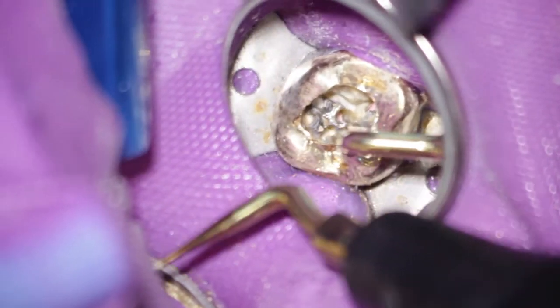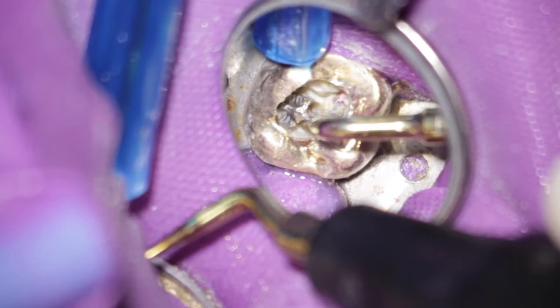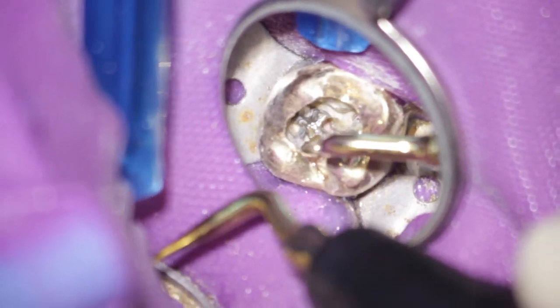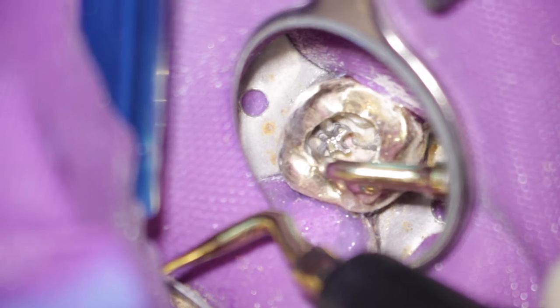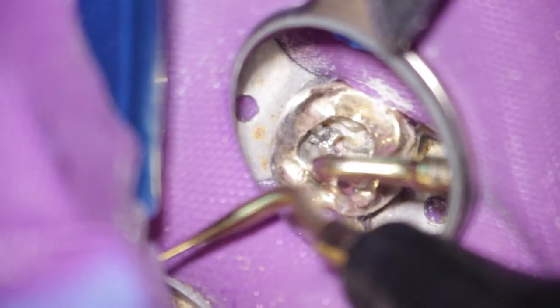And now it's time to use ultrasonic tips to free the gaps from the cement and resin. This is a coated Pro Ultra tip from Dentsply that works best with a piezoelectric ultrasound device, but also a pressure-driven sound device like the Sonic Flex from Kavo, with corresponding tips, will work efficiently.